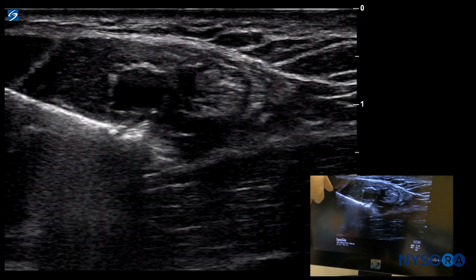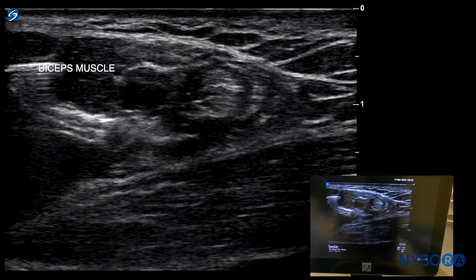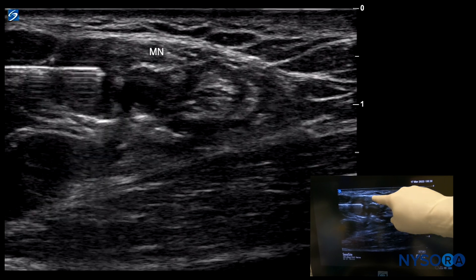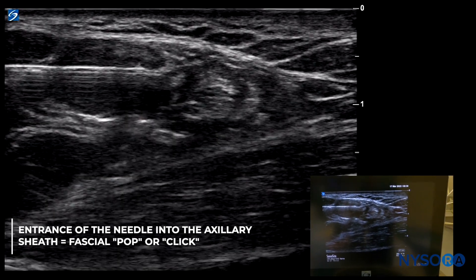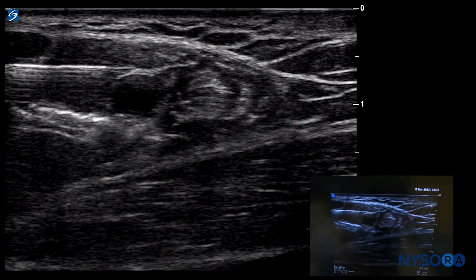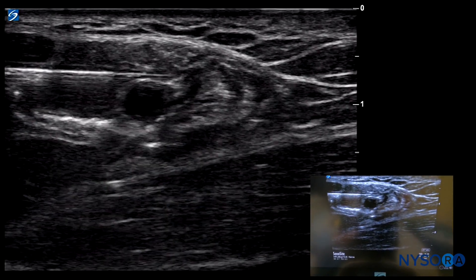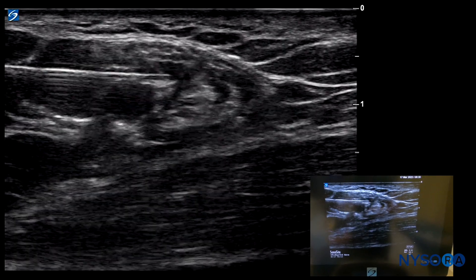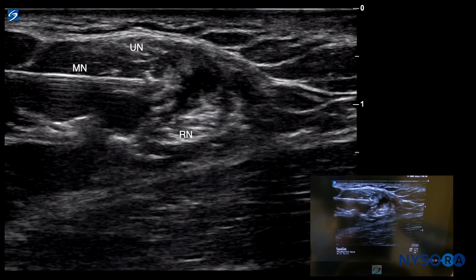We redirect the needle above the axillary artery. We're still going through the biceps and may get a local twitch. We want to negotiate our way between the median nerve and the artery without distorting the artery. There's a perceptible pop, aspiration is negative, twitch is absent, and injection starts. We advance the needle slightly to about the one o'clock position — aspiration negative — and there is very nice distribution of local anesthetic inside the axillary brachial plexus sheath.